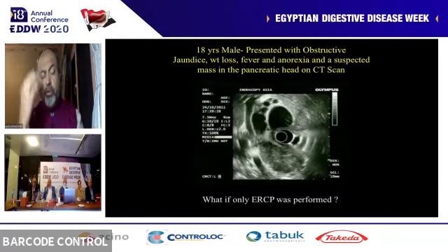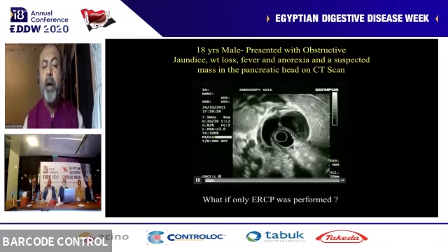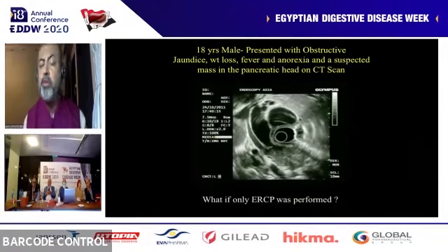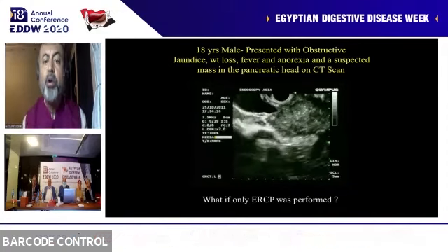Coming to a similar case of a pseudotumor, an 18-year-old young boy with a mass in the head of the pancreas, dilated bile duct, distended gallbladder. So why am I talking about pseudotumors? It will alter your management strategies as far as your therapeutic outcome or goals are concerned.